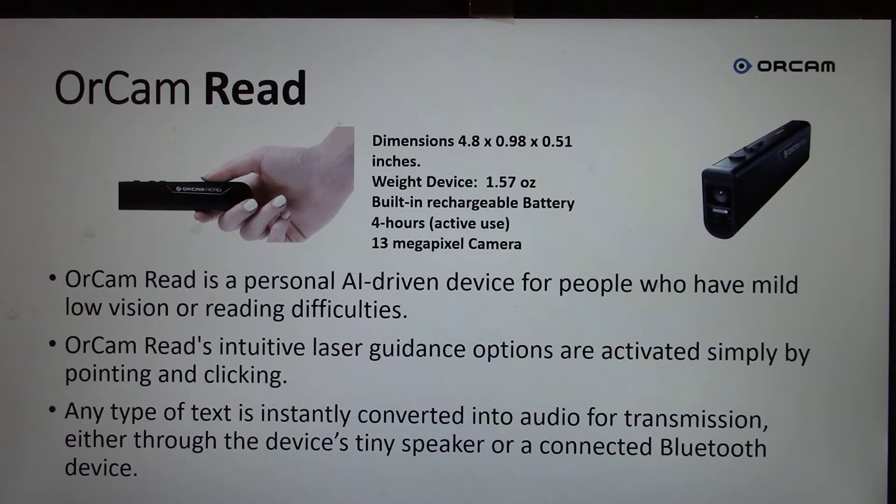On the computer screen we have a PowerPoint display. I'm going to point the camera at the dimensions. OrCam Read dimensions: 4.8 x 0.98 x 0.51 inches. Weight: 1.57 ounces. Built-in rechargeable battery: 4 hours active use. 13 megapixel camera.